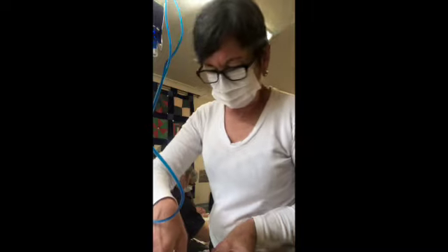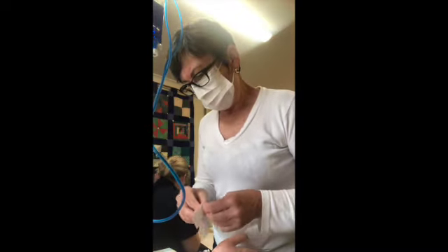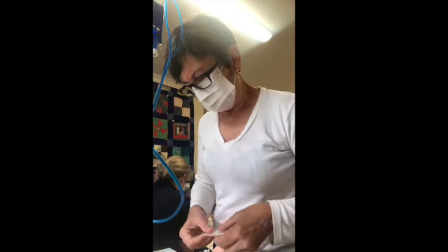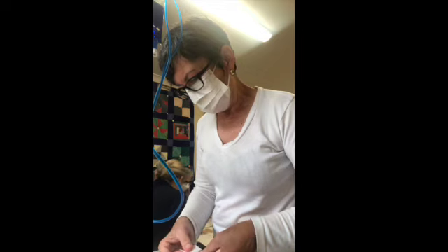Because there's nothing worse than if you've got a person that's been really difficult to cannulate, and if you don't secure it properly, you lose it. And there's other complications as well.